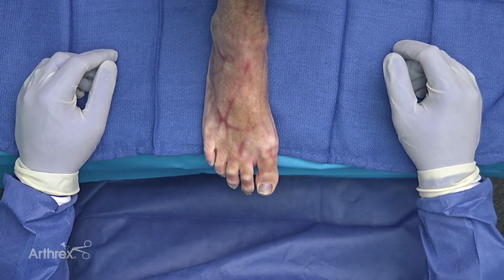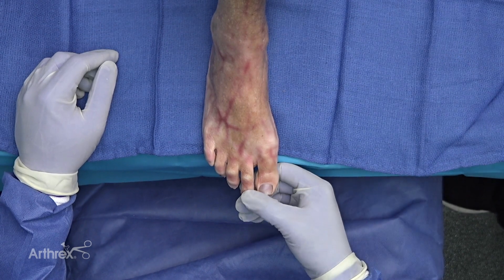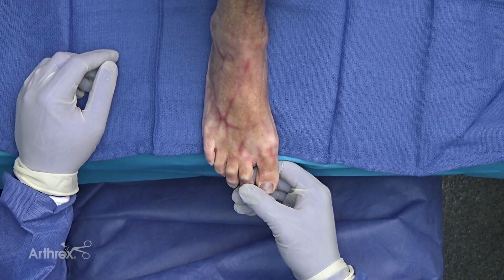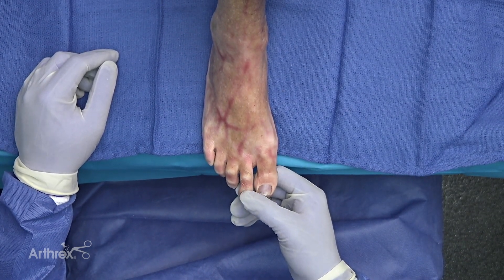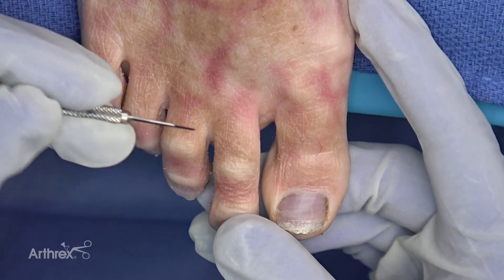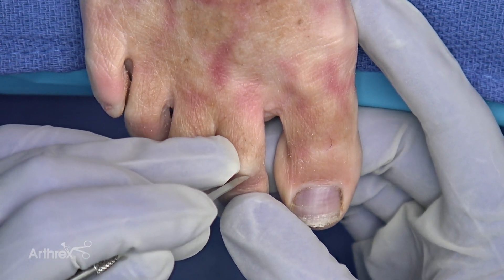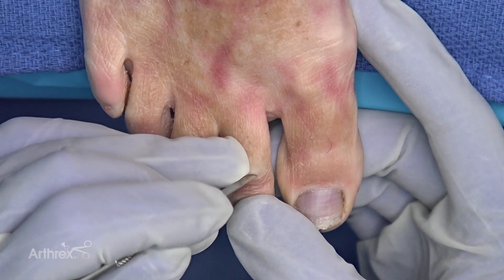We're going to be doing a hammer toe repair by PIP arthroplasty using the Arthrex minimally invasive instrumentation and the 2.5 millimeter compression FT screws. We have a right foot with a flexion contracture of the PIP joint, and we're going to address the hammer toe by addressing that flexion contracture.